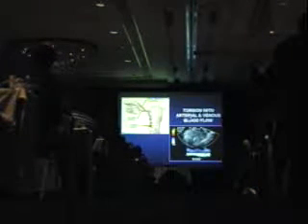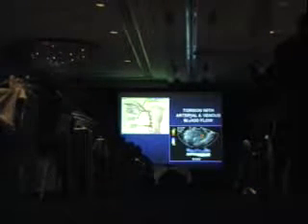As a matter of fact, this is that same woman, and this is deep in her cul-de-sac, unusual position, big ovary, tender to transducer palpation, and look what we have here, both arterial, and this ovary did not read the literature because it theoretically shouldn't have venous flow. But it just shows you may have a torsion a little tighter, a little looser, a little tighter, and you may preserve even venous flow.